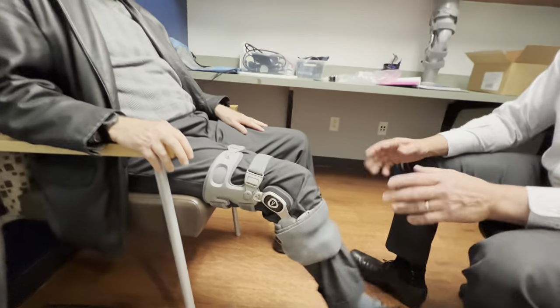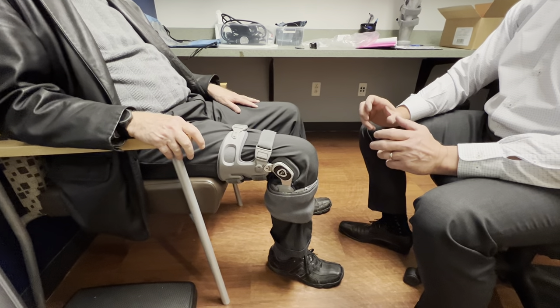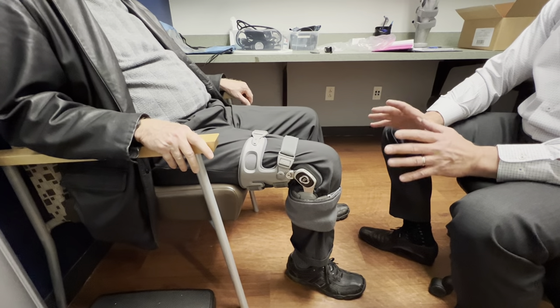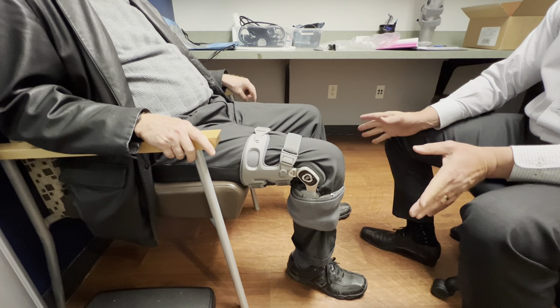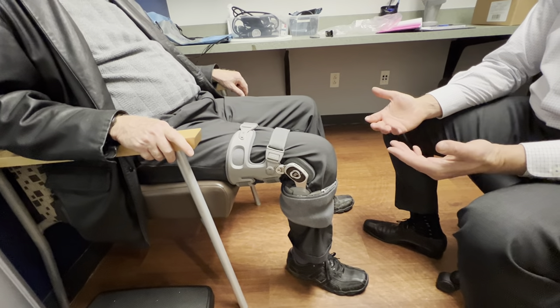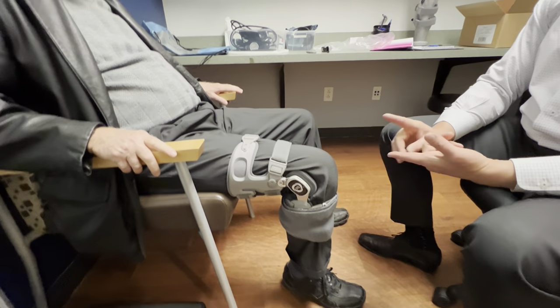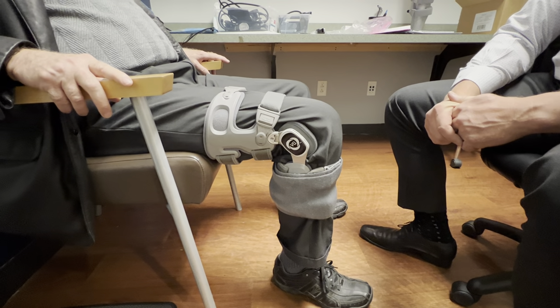Most people can get almost 100 percent relief just by using the brace with weight-bearing activity — whether that's golf, walking long distances, standing for long periods, hiking, walking on uneven terrain, or yard work. The brace is amazing if you wear it and put it on right. You don't need to wear it sitting at home on the couch or at night when you sleep — it's for weight-bearing only. We generally recommend trying it for two to three hours a day; if your activity demands more, wear it accordingly — for you, wear it when you walk for exercise and when you play golf.